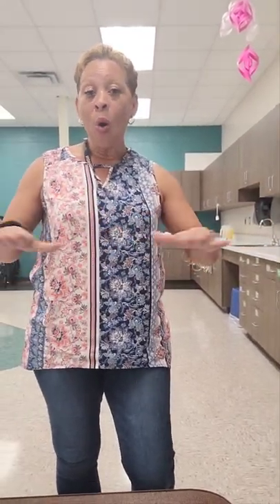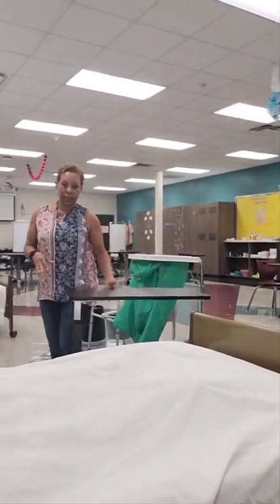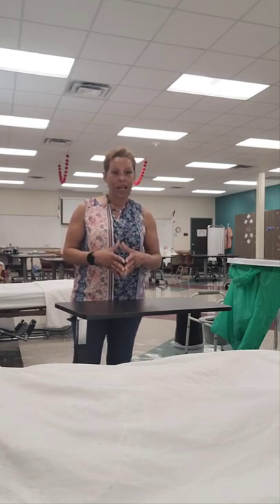I have my room set up for Prometric, as Texas is a Prometric state, so my supplies are right next to the bedside. But keep in mind for Pearson Vue and Credentia, your supplies will not be directly right next to the bedside. Also, Pearson Vue and Credentia do not require placing a clean barrier over the bedside table — that is an unnecessary step that can eat up your time.